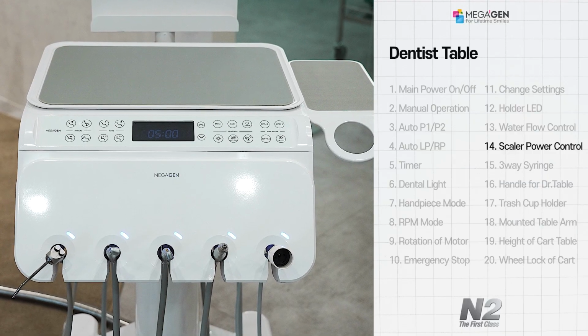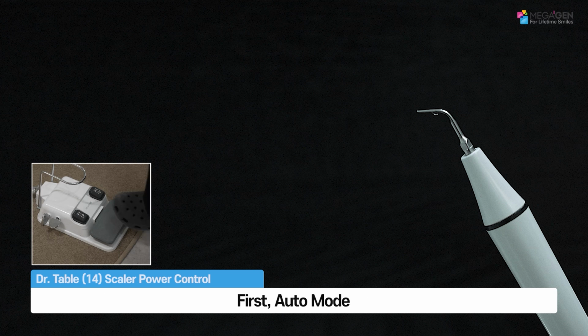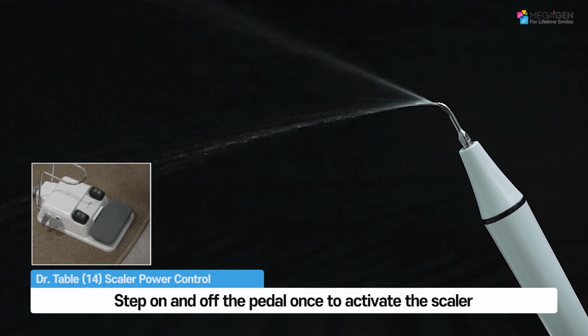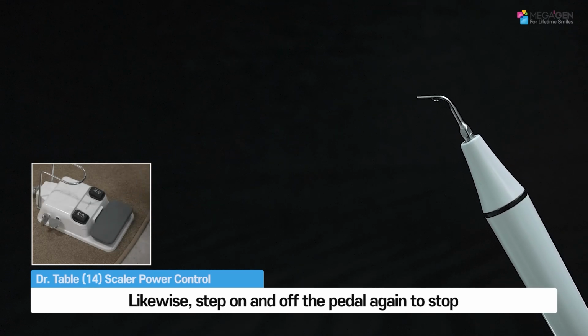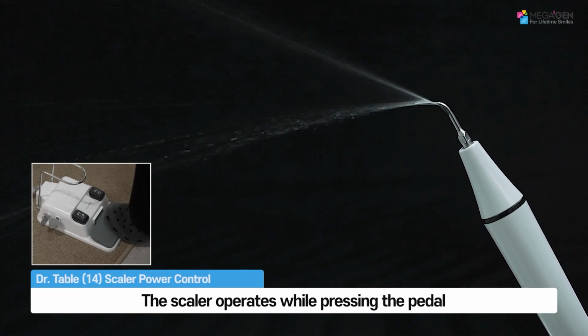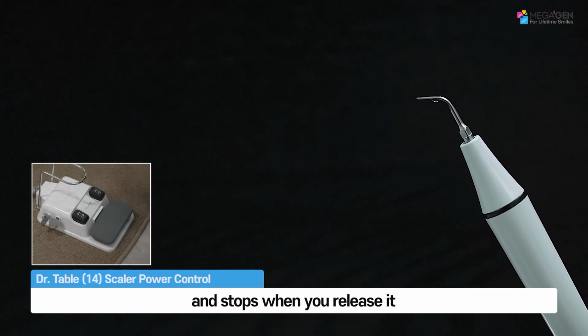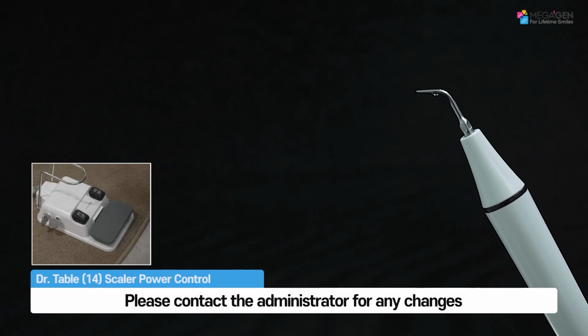Scaler operation and power adjustment. The scaler can operate in 2 modes, auto and manual. First, auto mode. Step on and off the pedal once to activate the scaler. Likewise, step on and off the pedal again to stop. Second, manual mode. The scaler operates while pressing the pedal and stops when you release it. The default is auto mode. Please contact the administrator for any changes.